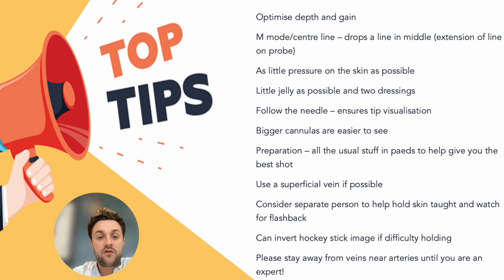Use as big a cannula as you think you can get into that vein. Now obviously quite limited in pediatrics, and usually it would be very small cannulas, and small cannulas you will be able to do this technique with no problem, but the bigger cannulas will be easier for the ultrasound for you to find, so just keep that in mind.